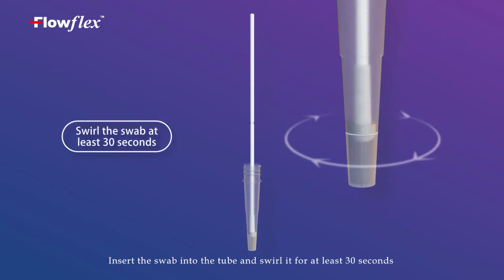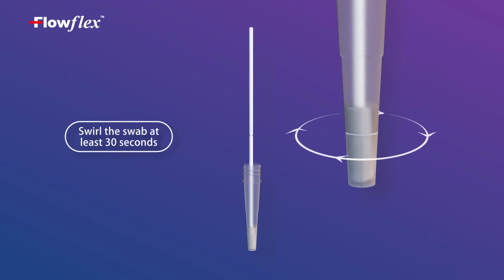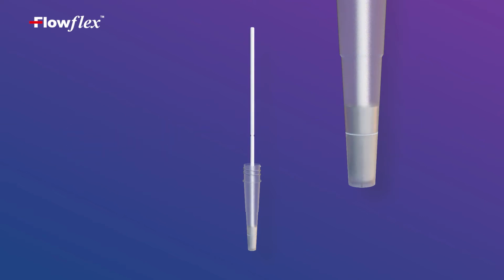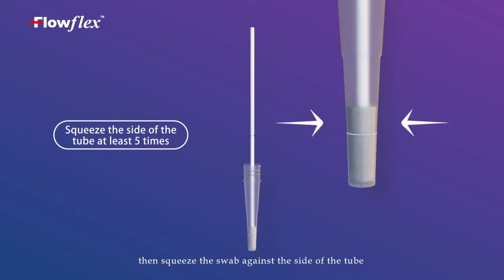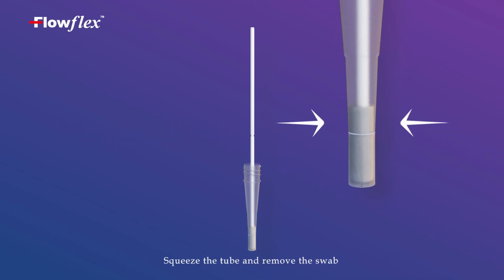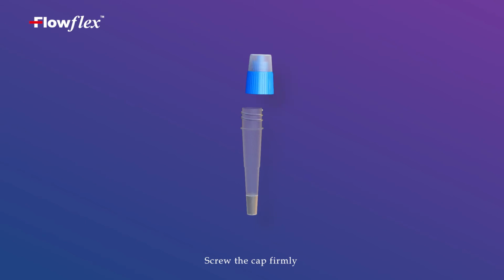Insert the swab into the tube and swirl it for at least 30 seconds. Then squeeze the swab against the side of the tube and rotate it at least 5 times. Squeeze the tube and remove the swab, then discard it. Screw the cap firmly.